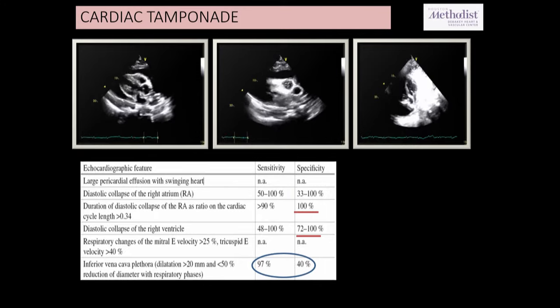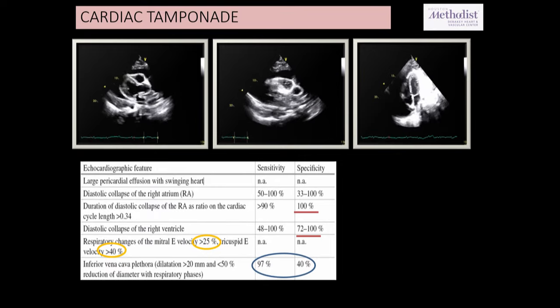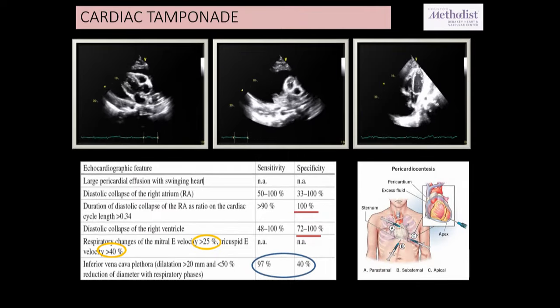The supporting signs, again, we just talked about, the respirophasic variation of the left side and the right side being diagnostic. And one thing I want to tell you, the cutoff for ASE is 30% and 60% as opposed to 25% for board purposes. But they usually give you pretty classic presentations for boards. And again, we just talked about the variability in certain cases, which we'll talk about soon too. Imagine a case of severe pulmonary hypertension, you're not going to see these typical signs. And an echo-guided approach to pericardiocentesis is definitely the first line, right? So what's the most common one, guys, when you see pericardial effusion?